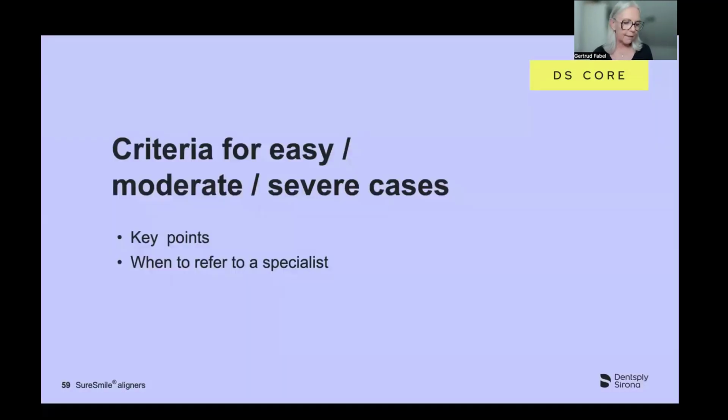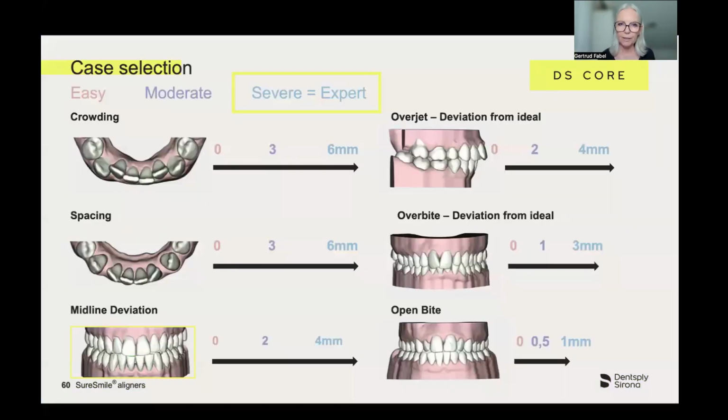Well, to make the decision a little more straightforward, to see what is an easy, moderate, or severe case, I've got some key points for you, and also when to refer to a specialist. So this is quite an overview. What number of crowding, spacing, and so on is a moderate case, and when to refer to an expert?